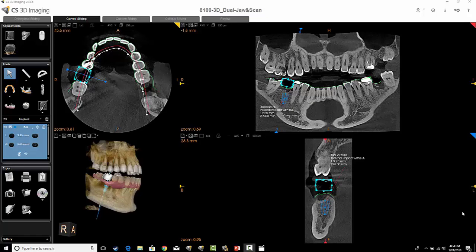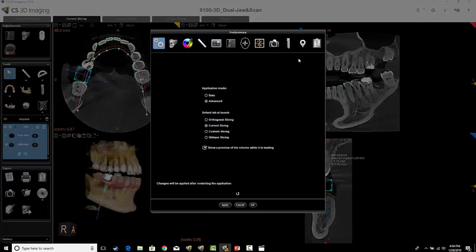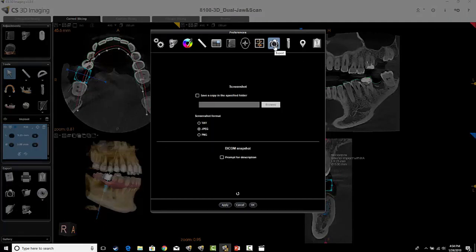This tutorial will cover some of the screen capturing and image capturing features of the CS3D imaging software. We're currently using version 3.8.6. You can start off by selecting the preferences and just double-checking your picture icon. Images are set to JPEGs. You can use TIFF as well, but JPEGs tend to be smaller file sizes and a little bit more universal.